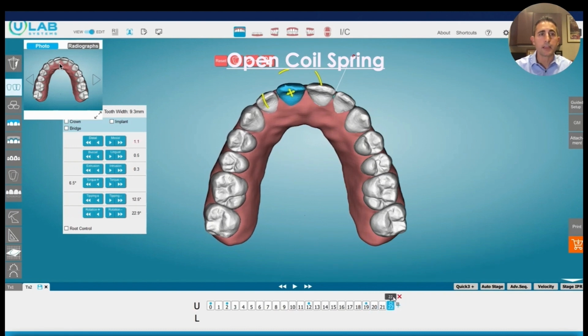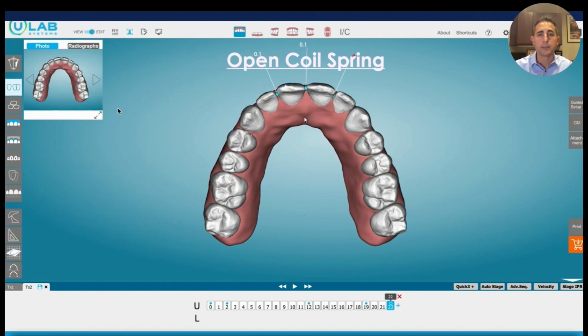So you can see here that in the mouth, the upper right one was mesiofacial distal lingual. So in this chairside refinement, we're going to see that the upper right one is now mesiolingual distal facial. We're overcorrecting that rotation and we're creating a little bit of space. We're essentially continuing to place force on these teeth and we're continuing to make progress on the case via a chairside refinement. There's no new refinement scan.